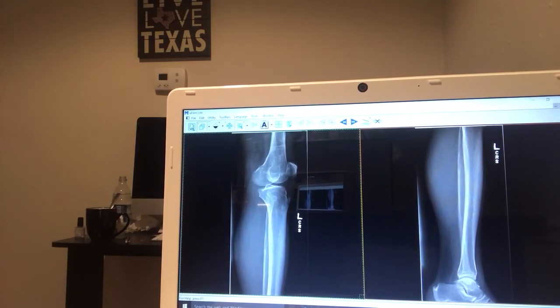I didn't have him remove his pants, and I should have, because as we know, digital images will show everything. So those should have been removed to make sure that there were no mistakes made by thinking that there was something there when there really wasn't.